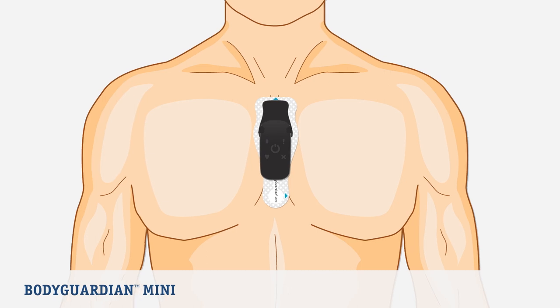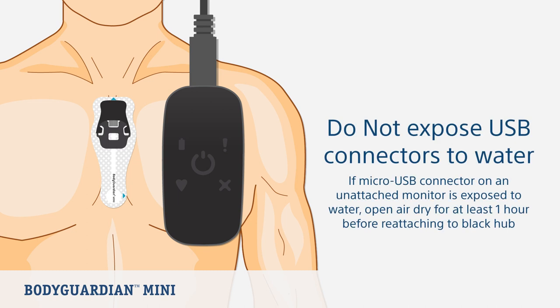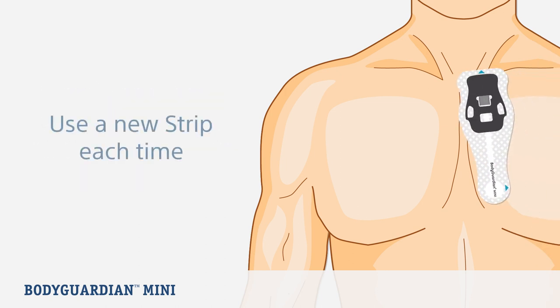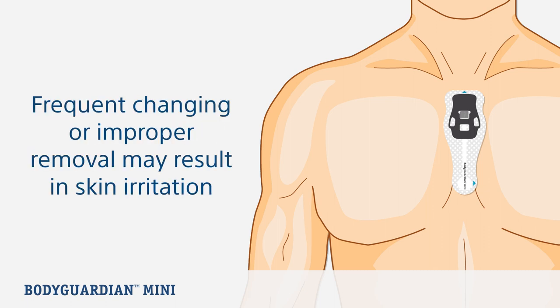Now let's look at replacing the strip. If the strip is no longer adhering to the skin, strips are disposable. First, make sure you remove the monitor from the black hub, then plug the monitor into the provided charger. To protect signal quality, it's important not to expose the USB connectors directly to water. To limit the potential for skin irritation, you can remove the strip while showering or with lukewarm soapy water. The strip is easiest to remove by slowly peeling and rolling back the adhesive furthest from the black hub. Use a new strip each time to reattach the BodyGuardian Mini to your chest — do not rip or tear off the strip too quickly, as more frequent changes or improper removal may result in skin irritation.